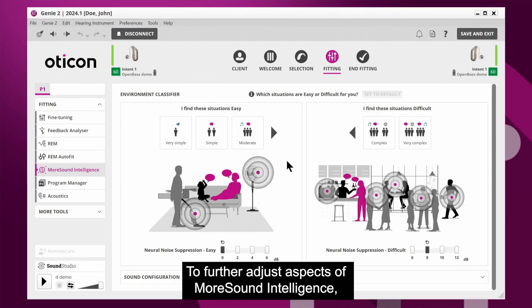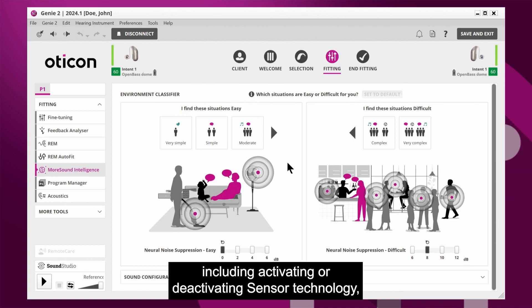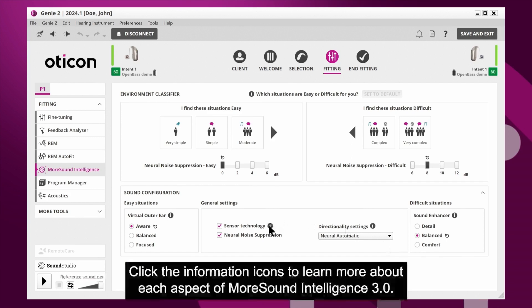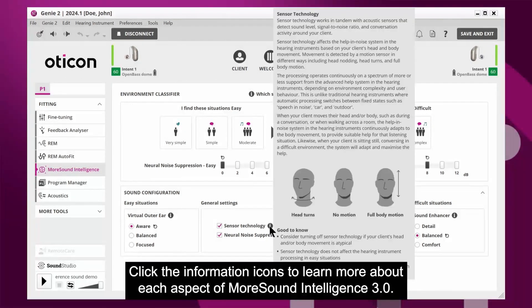To further adjust aspects of MoreSound Intelligence, including activating or deactivating sensor technology, you can expand the Sound Configuration window to find more options. Click the information icons to learn more about each aspect of MoreSound Intelligence 3.0.